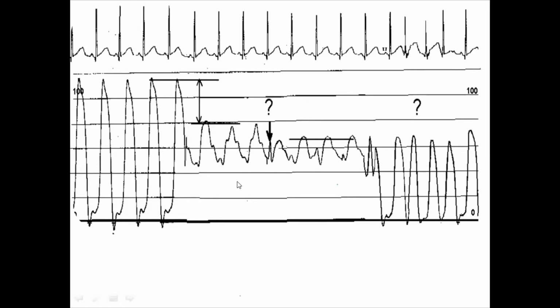Okay, what do you see here? This is showing intra-aortic balloon pump with late inflation. This one, there is no intra-aortic balloon pump. Just to help you, this is the LV. This is the aorta. What does this double-headed arrow point to?